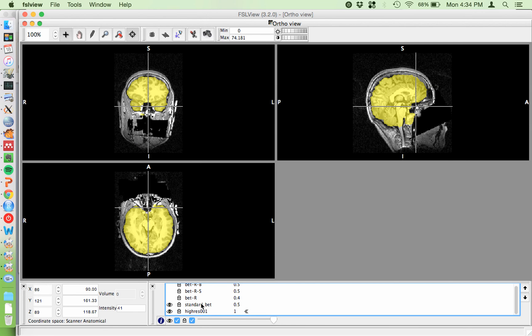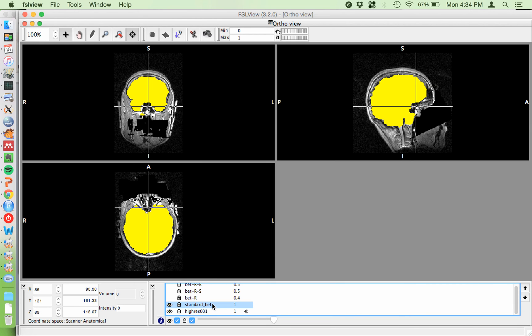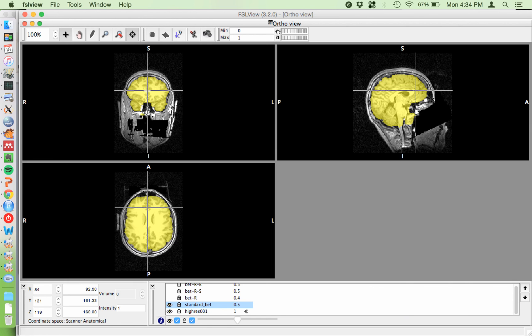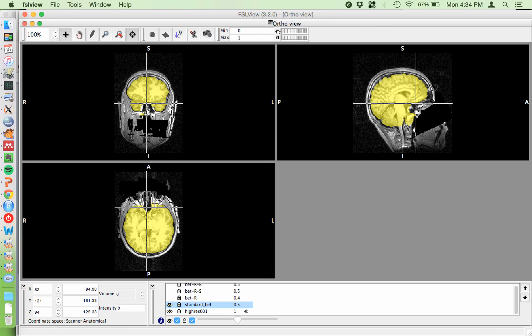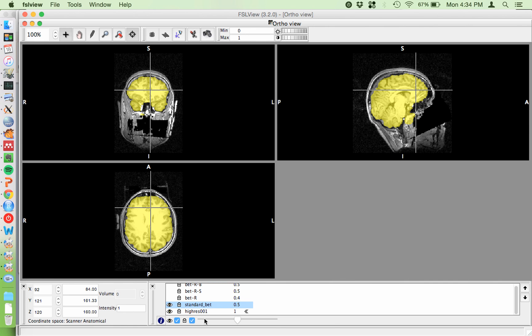Here is an example — this is like a cooking show where suddenly things are already prepared. I've run BET with a lot of different options. This is the standard BET: I loaded up the brain with the skull, and this is the mask created using BET without any flags except minus M. Using the slider at the bottom, you can make the overlay opaque. I typically start at the top of the brain and go down — usually things go wrong around the eyeballs. You can see it's getting a little too much non-brain here, but otherwise it's doing a good job.